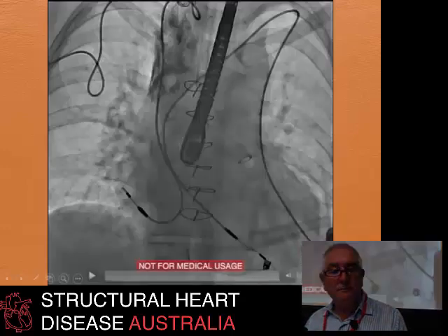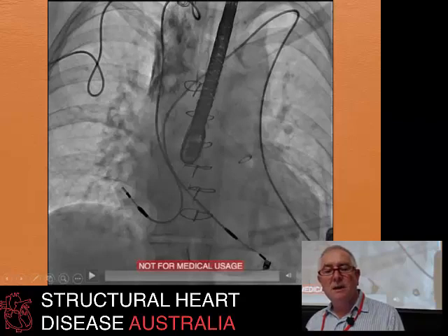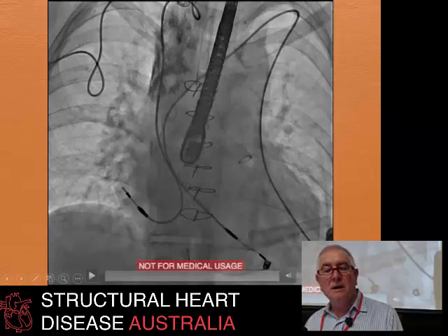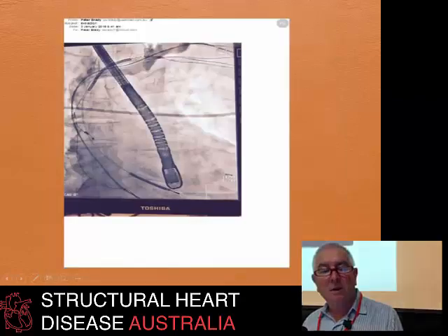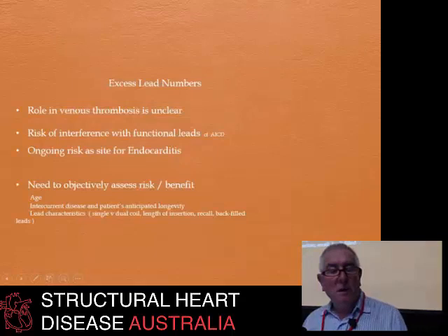others don't. This is a patient that I saw with 1 lead going down from the right side that had been abandoned, a new lead placed in from the left side that was still in position, an abandoned epicardial lead, and yet as you can see here from the venogram, thrombosis of the top part of the superior vena cava. This is another patient who's got a whole host of defib leads and abandoned leads in, and a venogram taken from the left arm with the dye not going beyond the junction of the SVC and the innominate vein.